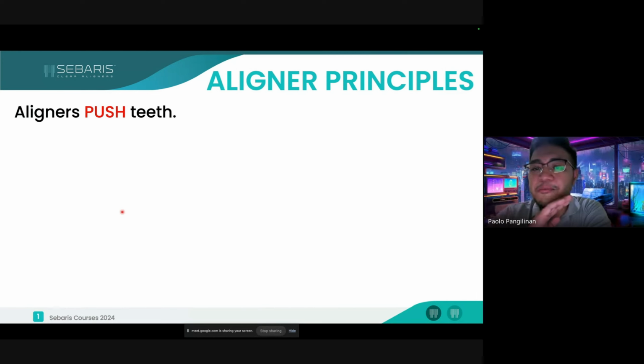Basically, doctors, predictability and the use of your auxiliaries actually rely on basic principles. I'm not going to go through them one by one, just a breeze through, it's only five things. The first concept is aligners push. If you're looking at your cases with a context of pull, similar to how you think of your conventional appliances, your treatment success is going to be a little bit different because the perspective is different.